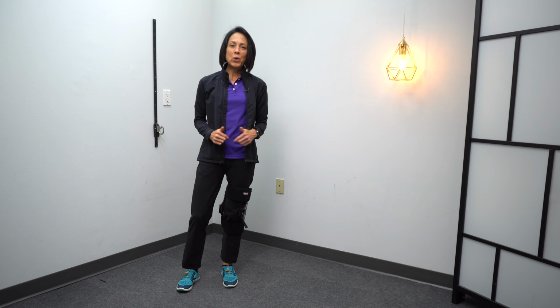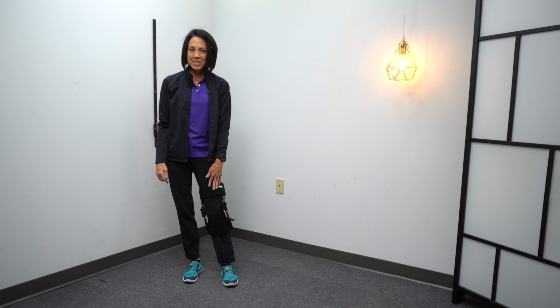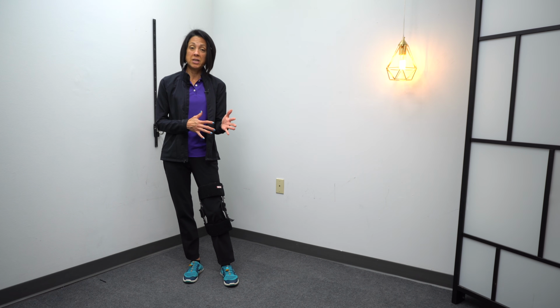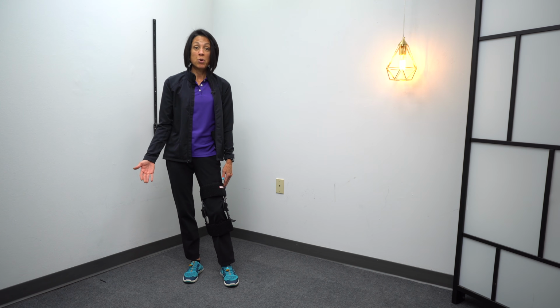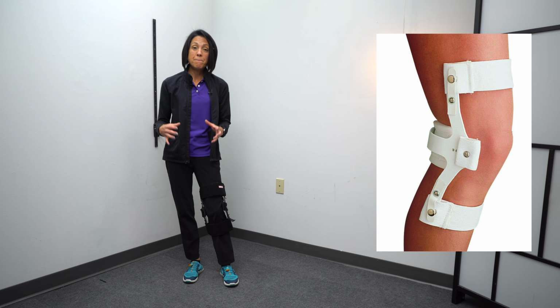All right, the next tool that made the list is a Swedish knee cage. Now, I know I'm wearing a black Swedish knee cage in this video. I don't recommend the black one on Amazon. It works for me here because I don't use it very often, and I'm doing a lot of manual cueing with patients that I see in person. When patients have used this on their own, the black one is made of plastic and it breaks. There's just too much force for the plastic. The white one is metal, and I highly recommend that if you're going to go the Swedish knee cage route, even though it's more expensive, you purchase the white one.